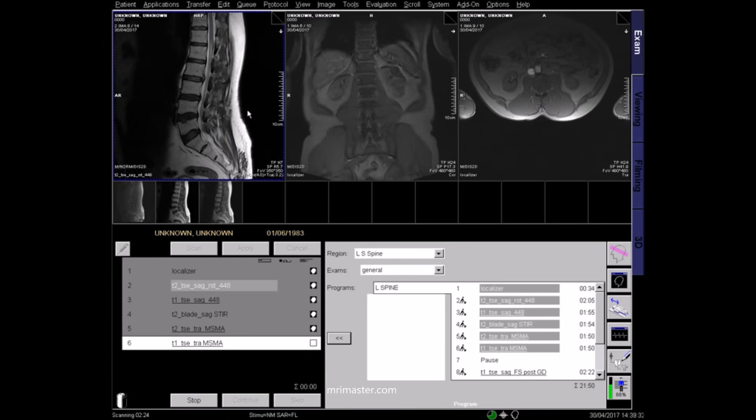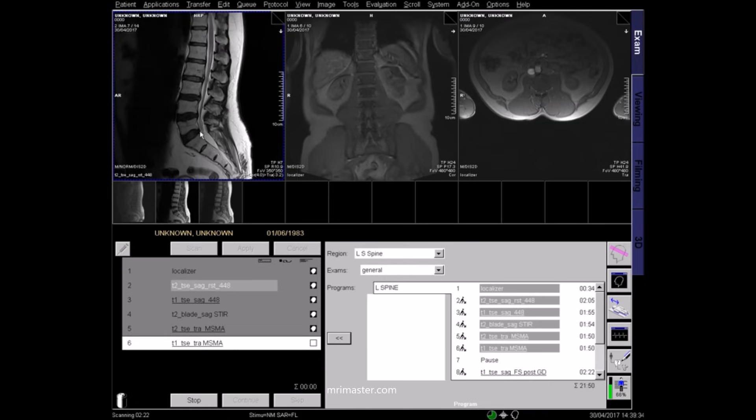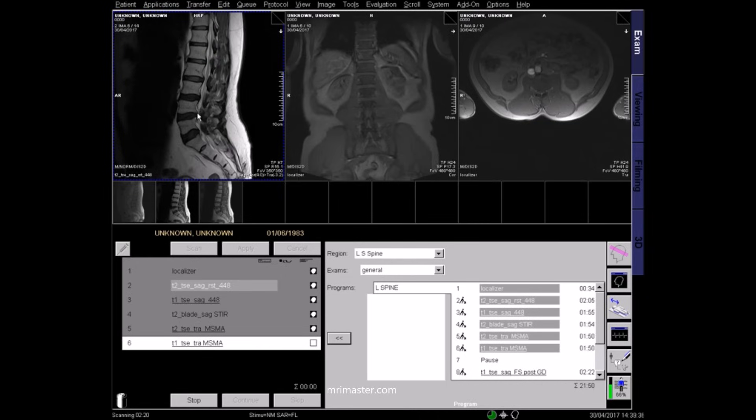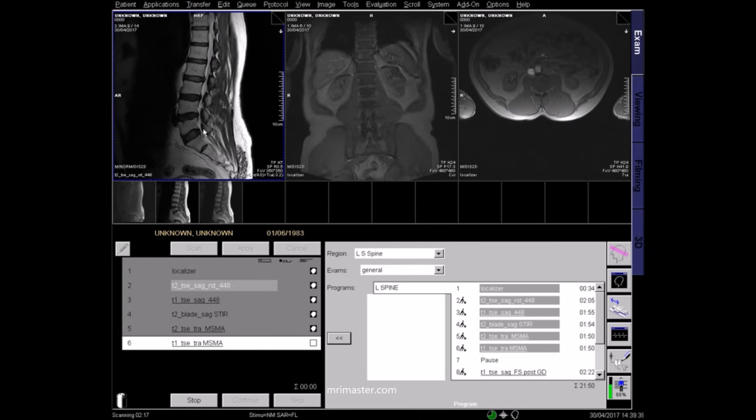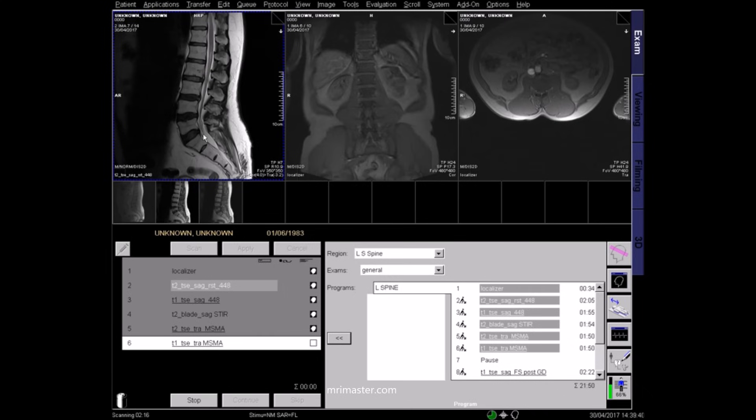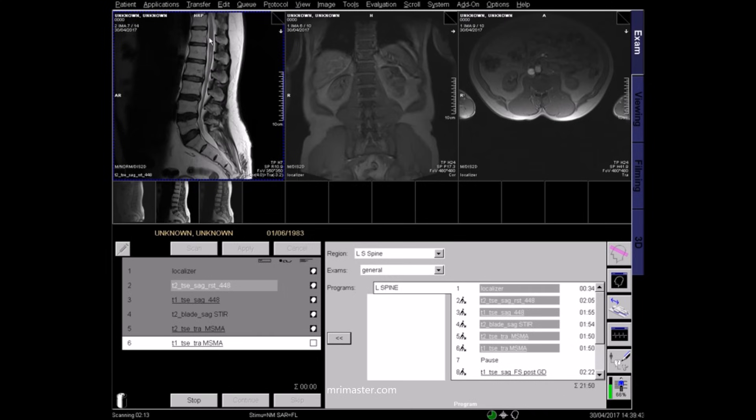You should review your images as the scan proceeds. This is a T2 sagittal image, where fluids and fat appear bright. Here, you can clearly see the cerebrospinal fluid surrounding the spinal cord and conus.